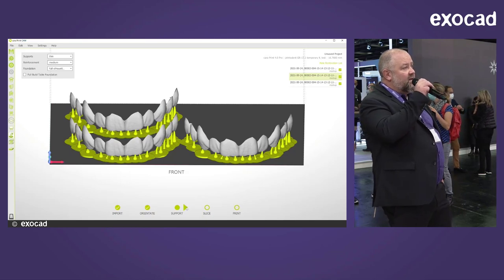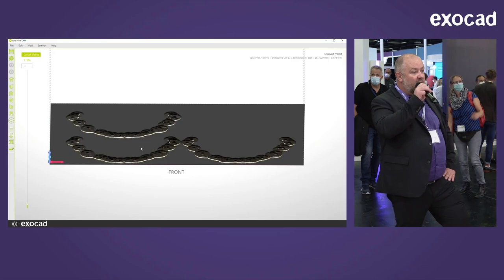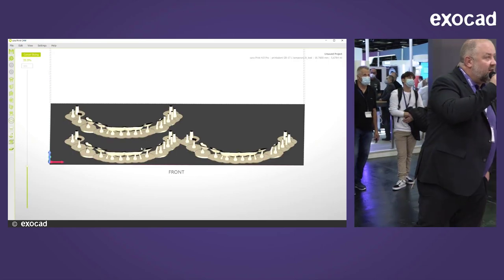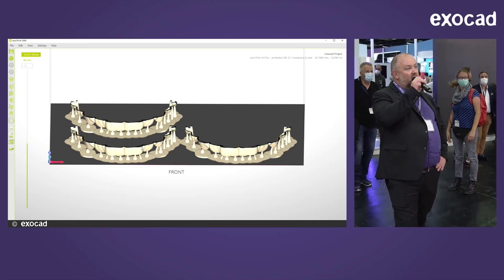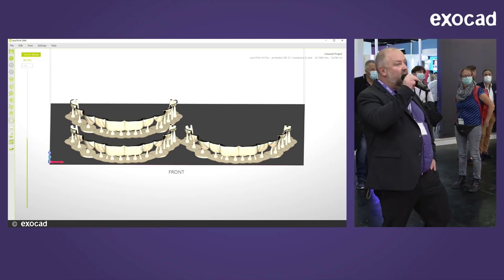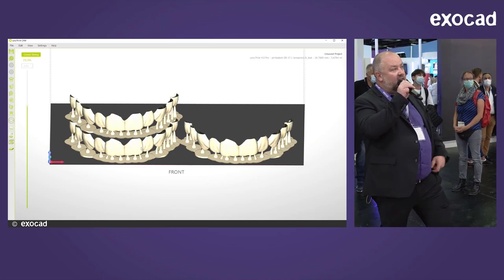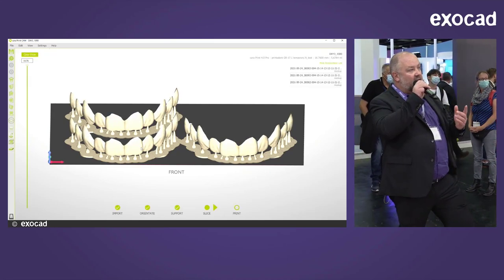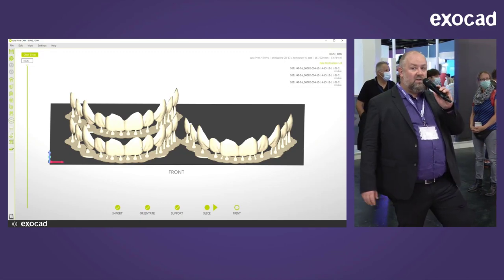That's essentially all. Now the file has been sent to the printer. What you see is the slicing process being simulated by the software in real time. The software prepares the file for the printer with exactly this information, and the printer will later do exactly what you see on screen. The case has been sent to the printer.